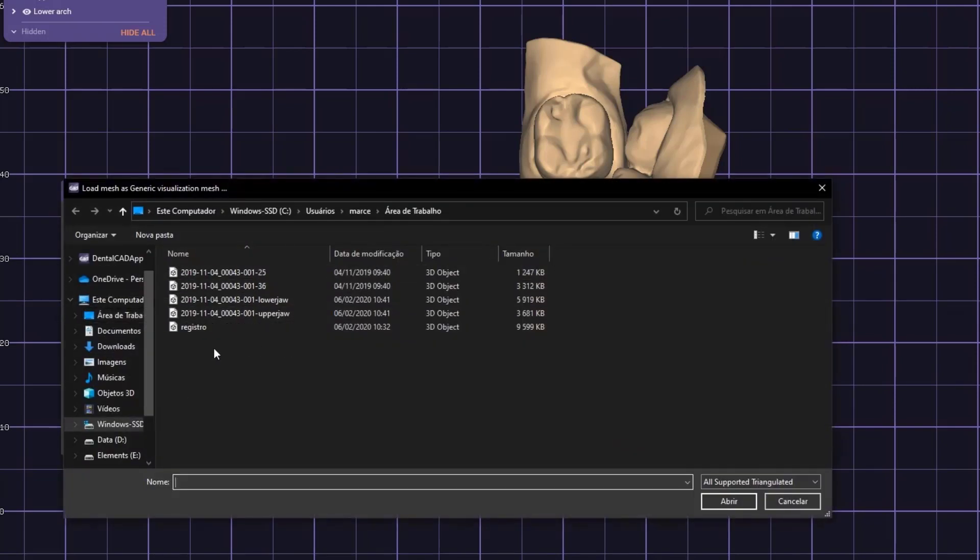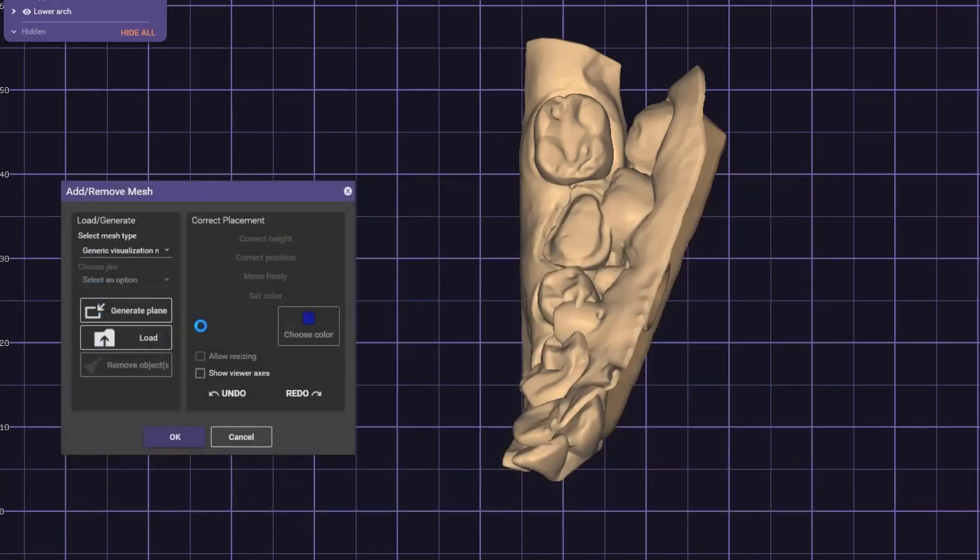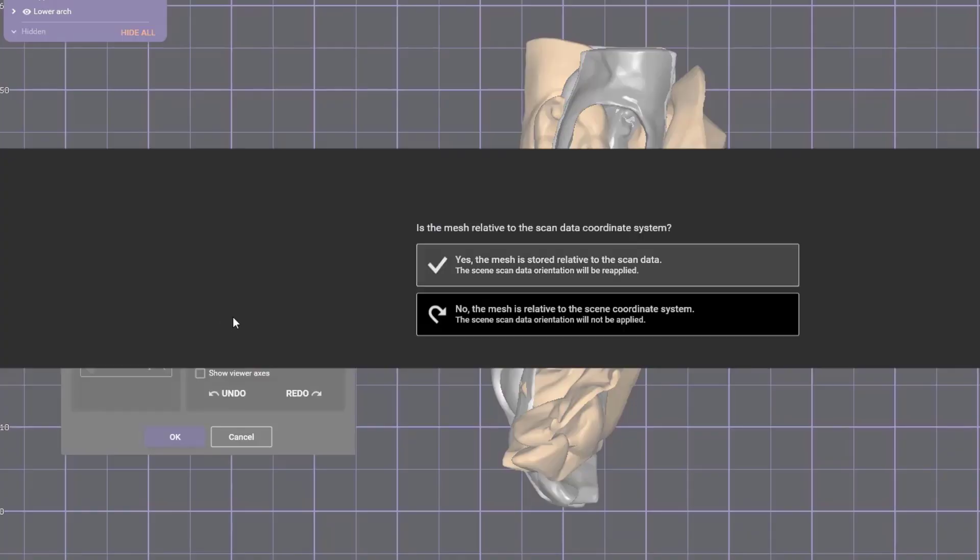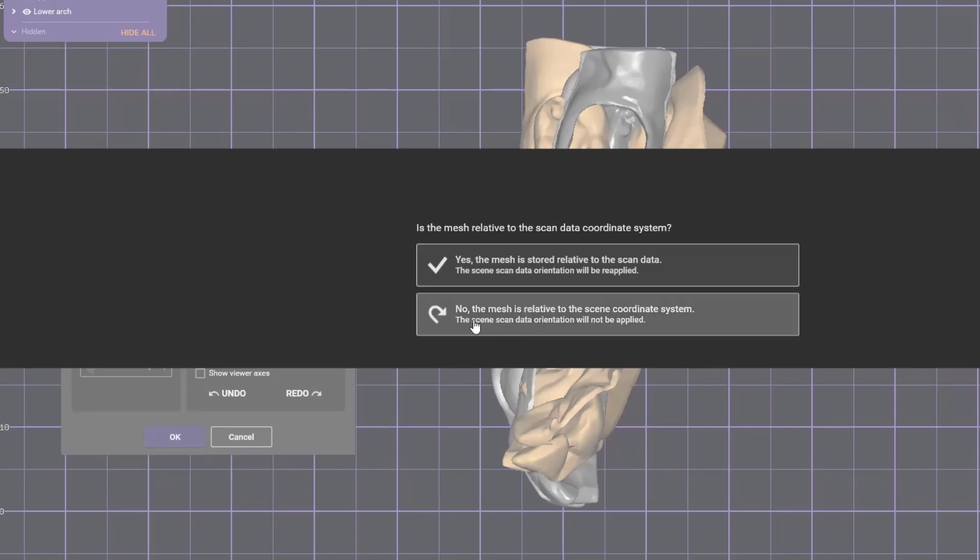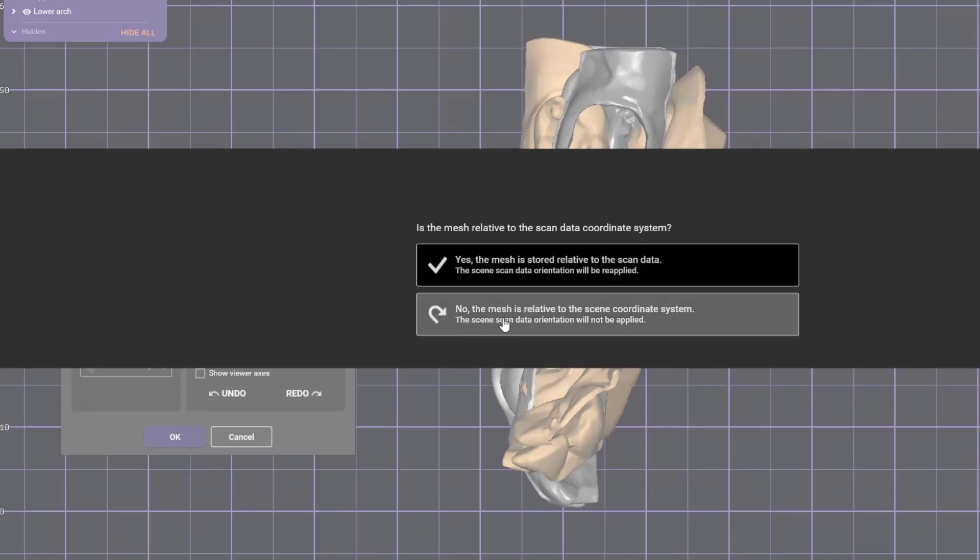Click load and choose the STL, the bite scan STL. Here you can put yes or no, doesn't matter because it isn't in the right position. I'm going to put no.